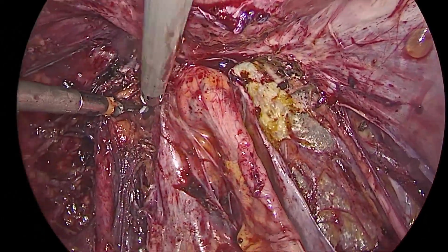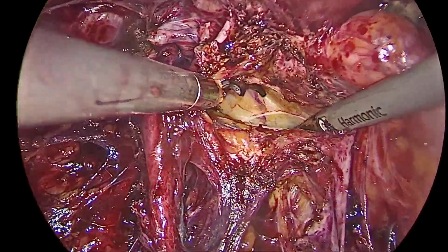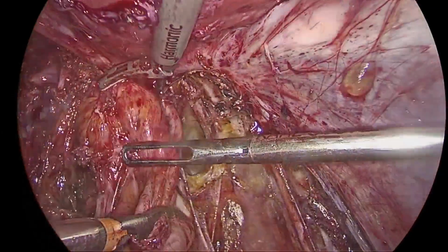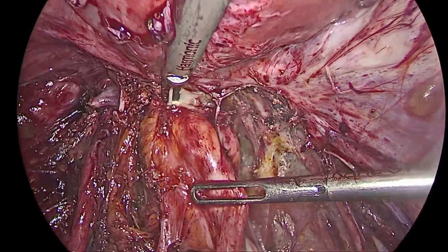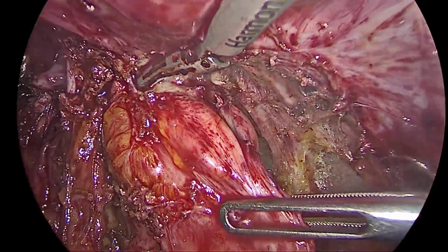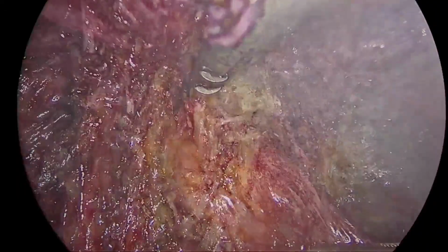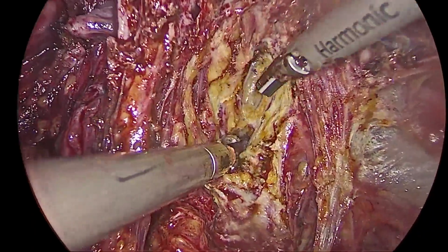To define the borders of the rectum, the pararectal spaces are dissected on either side of the rectal wall. This allows us to isolate the rectouterine fibrosis that most often lies in the midline. The rectal nodule can then be shaved from the posterior uterus, leaving disease on the bowel. The shaving is pursued until the healthy rectovaginal space is encountered.